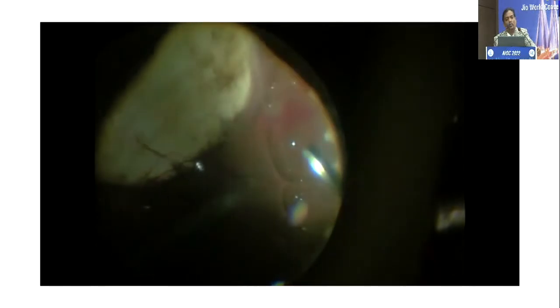Just to end, this is a small video of a case which had a coloboma and also had peripheral tears. Here I have done a combination of both. The visualization was not good, so I have done a 360-degree encerclage along with the vitrectomy. And this patient did well, and the patient has got good responses. So many a time, select your cases well, and we really don't have to pit both against each other. Combine both, and I'm sure we are assured of a good result.